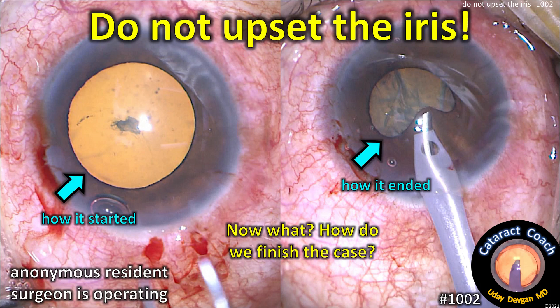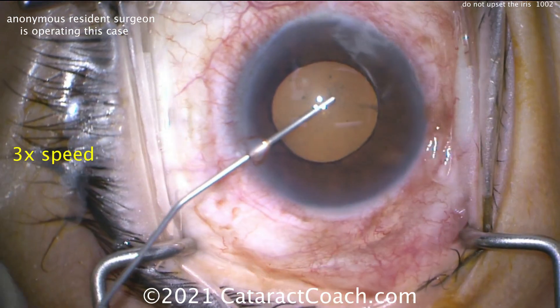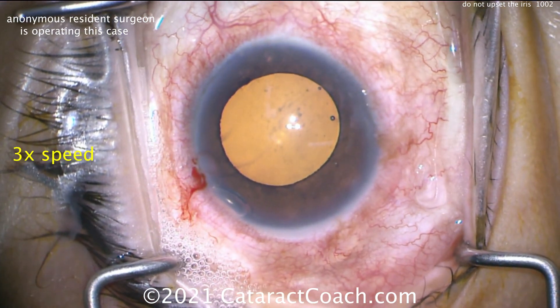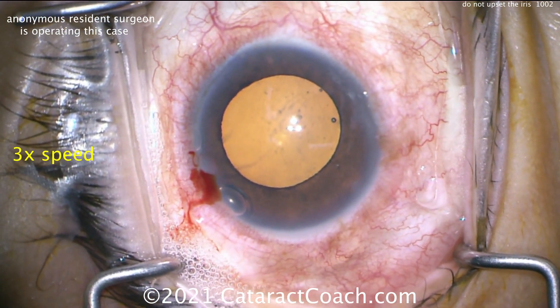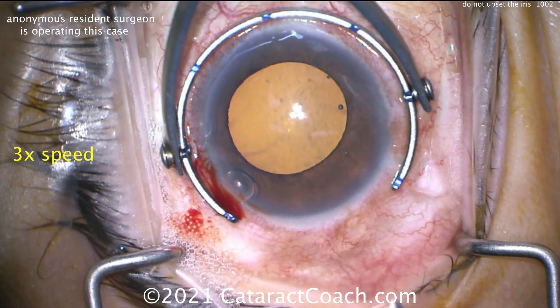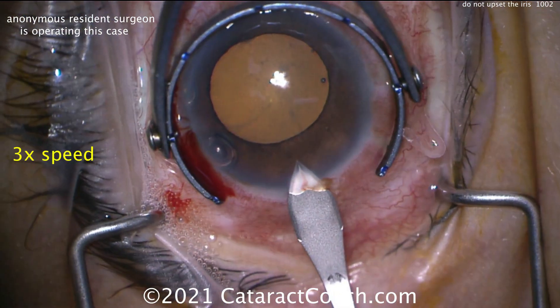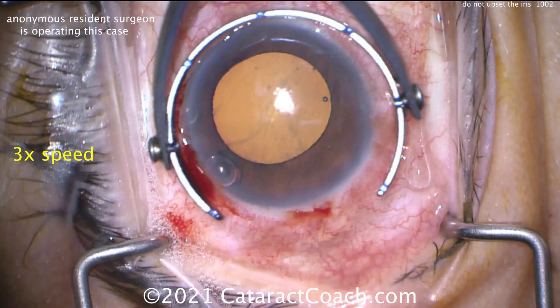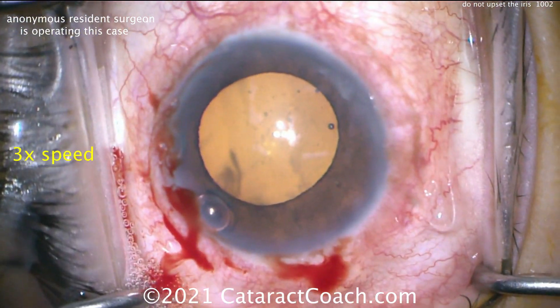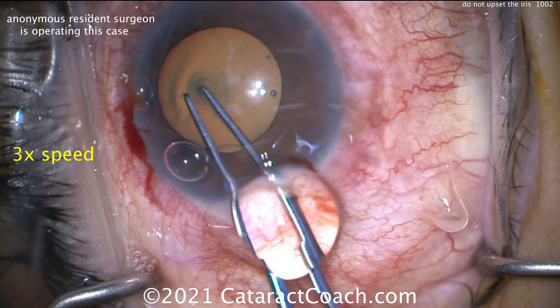CataractCoach.com. Do not upset the iris. Here's how it started, here's how it ended — not that pretty. Let me show you this case. We're going to speed it up to three times normal speed. We've got an anonymous resident who's operating. There's the pupil size — pretty reasonable, especially with that viscomydriasis. Looks pretty good. Main incision being done now. Going in here, a little on the short side maybe, but not terrible — not a bad incision.